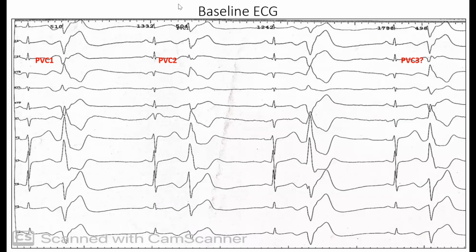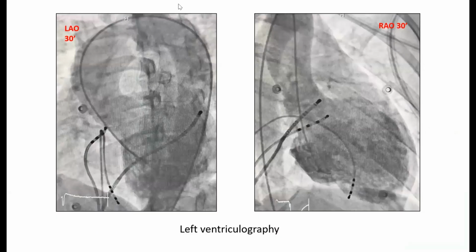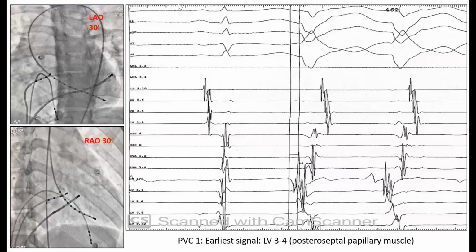Mapping with two catheters is faster than mapping with just one ablation catheter, even though you have a good angiogram and can see the posterior papillary muscle nicely in the 30-degree angle, as pointed out earlier. But you don't actually know where your catheter is on the posterior, free wall side when you put it in. So having two catheters gives you a better reference for how to move a catheter, especially in the setting of no 3D.